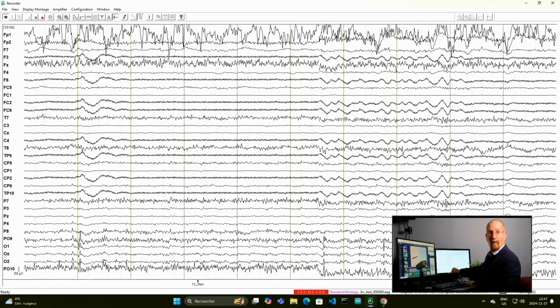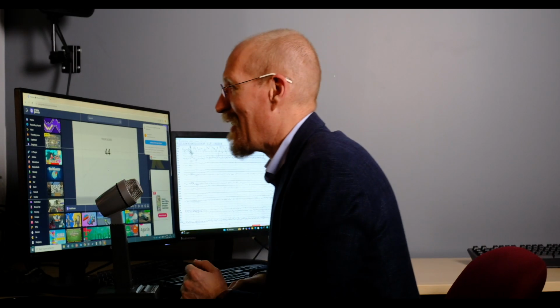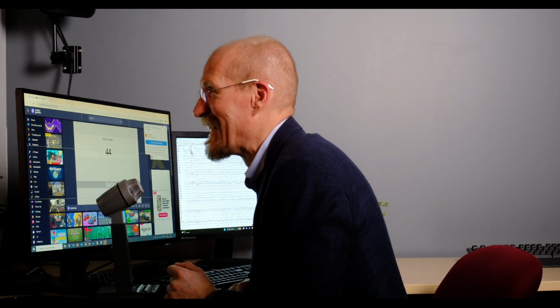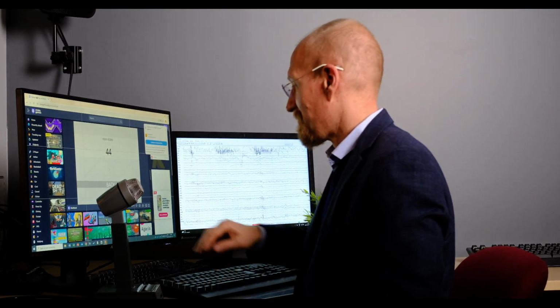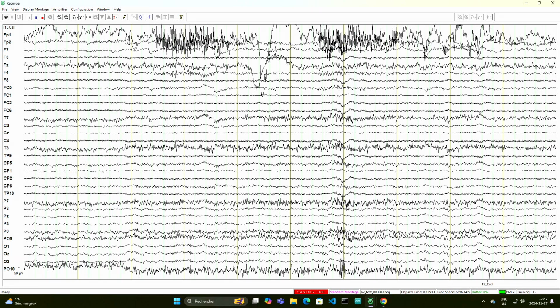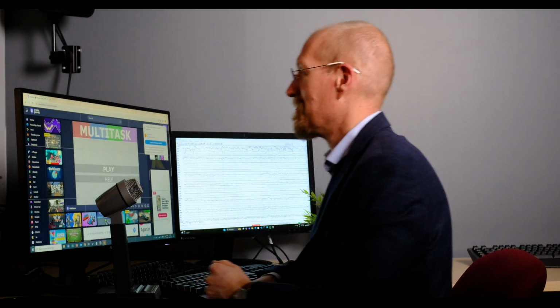So I've added my marker for the next trial. And you can see that it's so difficult. Quickly the ball fell off. Good job, Anne. It's very hard. You want to try again? Yeah. Okay. So I made sure I added my end marker. Go ahead and play some practice ones. Okay.